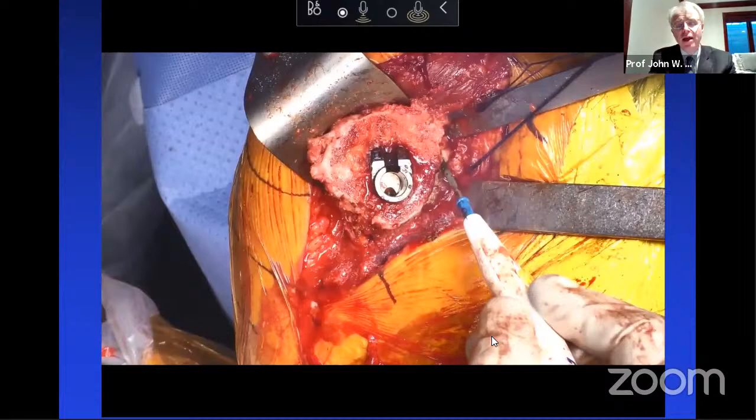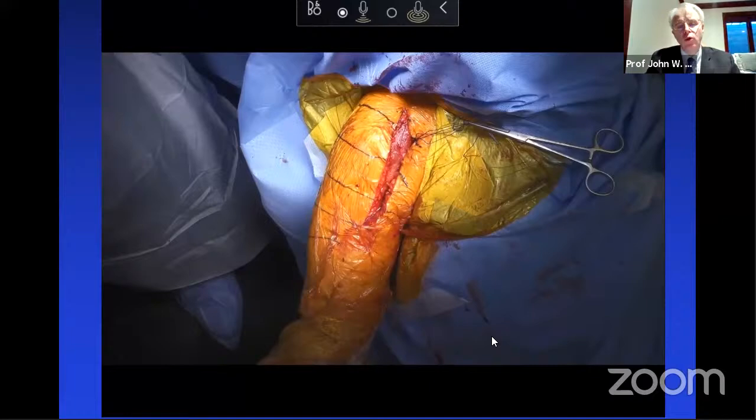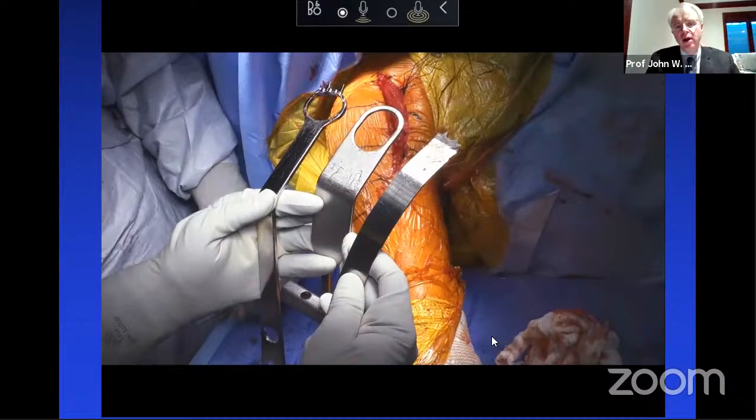On the glenoid side, I like to sit the patient straight up and down. Try this trick. It'll really help you with glenoid exposure. There's different glenoid retractors. I like to use a retractor that has a hole in it. On the left, that's that glenoid access retractor. The center is the Fukuda, but the glenoid access retractor is my workhorse.